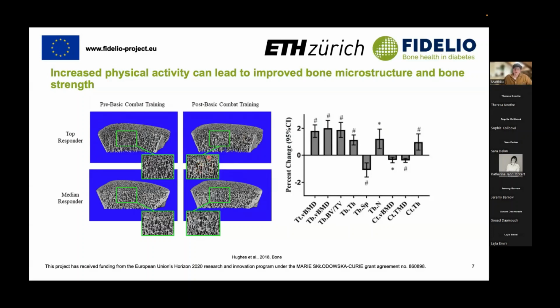And when we now look at the other microstructure measurements, such as, for example, down here, trabecular thickness, trabecular separation, trabecular number, or cortical thickness, we can see that all of these have improved through the physical stimulus, this mechanical stimulus through the activity. And so this shows really nicely how mechanics can improve our bone health and how they can offset these negative effects of other diseases, as we've seen before in fracture subjects. All of these parameters were mostly reduced.